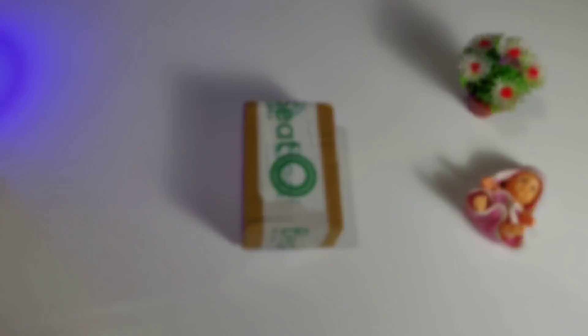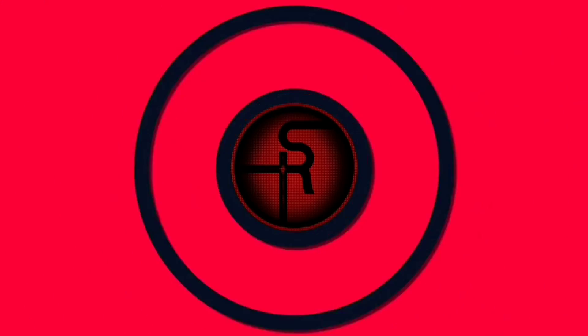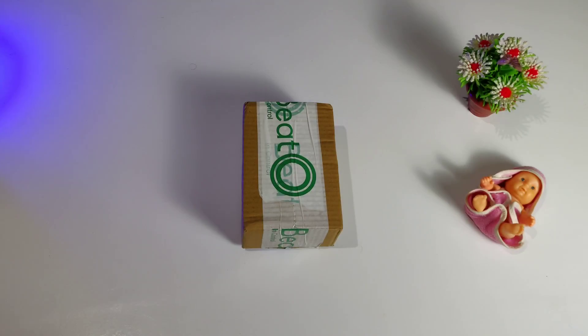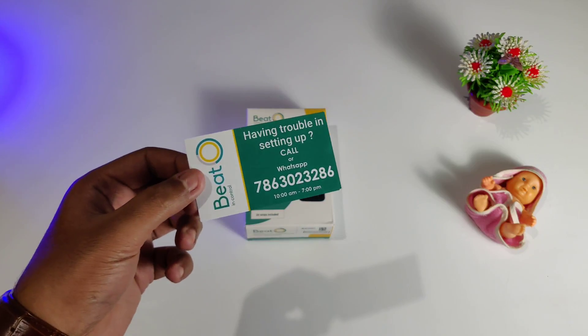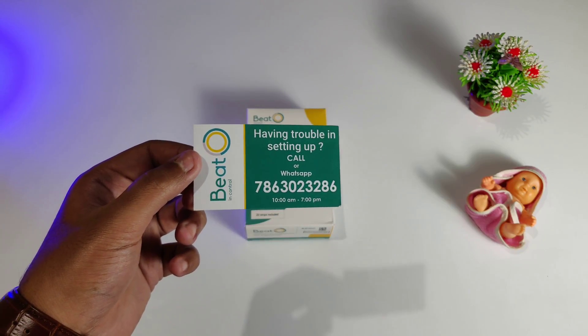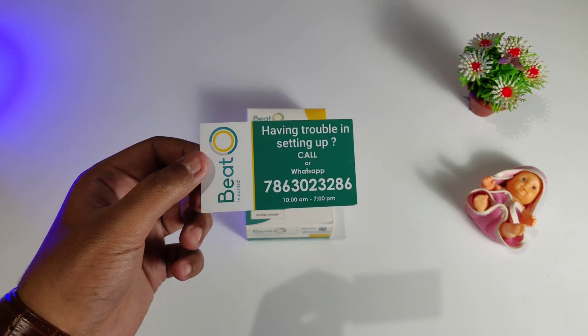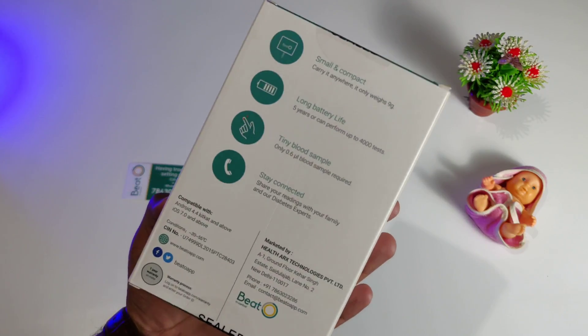So without wasting any more time, let's jump straight into the video. If you are concerned about your health then definitely check this product out. Now opening up the box, the first thing you want to know is you get a card which has its own WhatsApp number. So guys if you find any type of issue or trouble with your device and not able to use the device properly, you can call them and also WhatsApp them to get assistance.